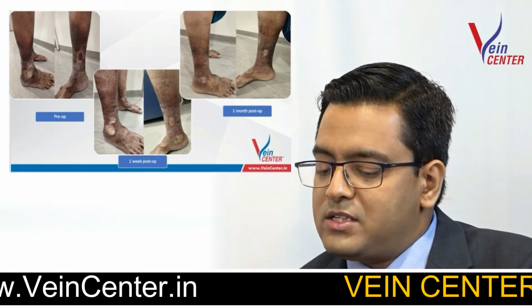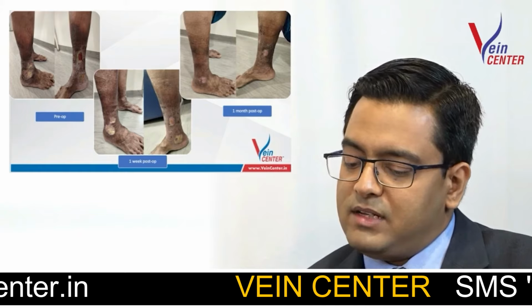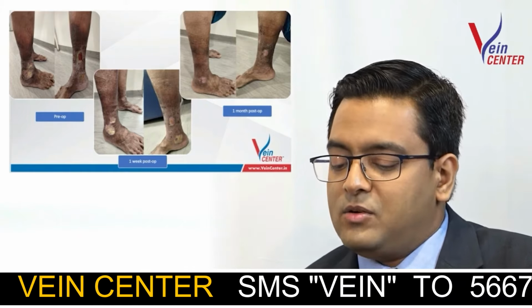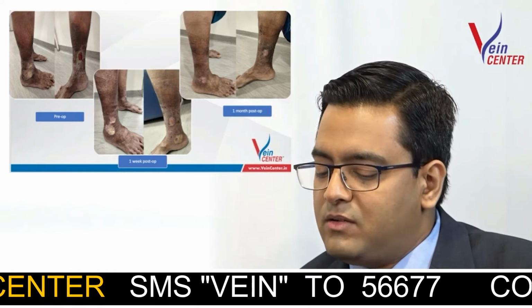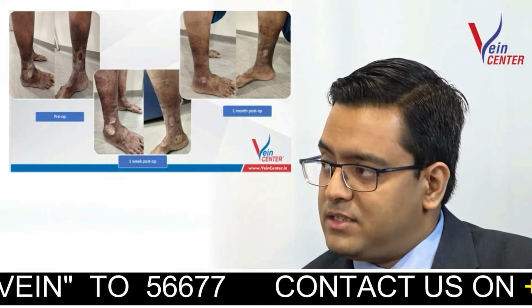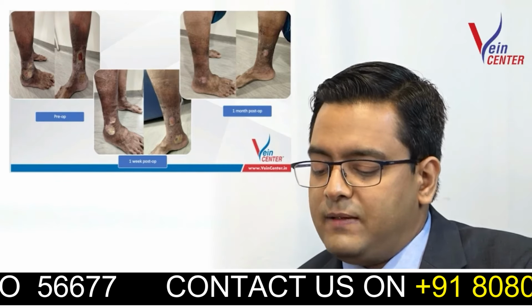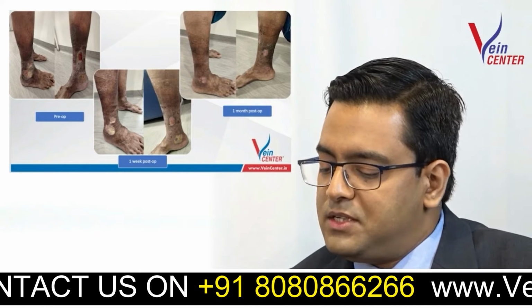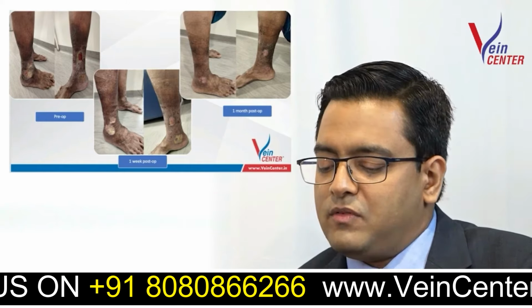And we reach right under the ulcer and deliver the VenaSeal under the ulcer to close the big bulging veins. We see that, pre-procedure, this lady had these big wounds on the leg. This is an elderly lady, probably around 65, 66 years old. And we see in the 1 week follow-up, the wounds have started healing. And 1 month post-procedure, the wounds are completely healed.